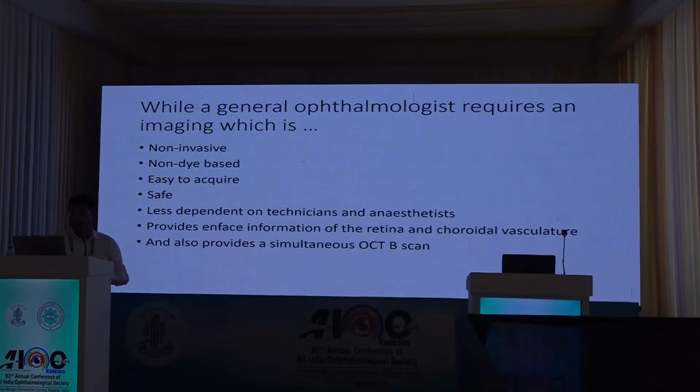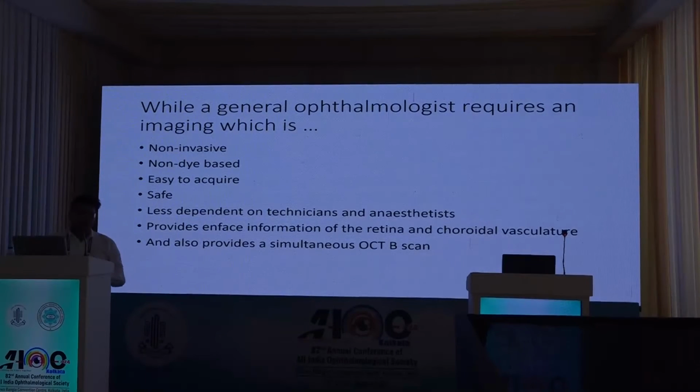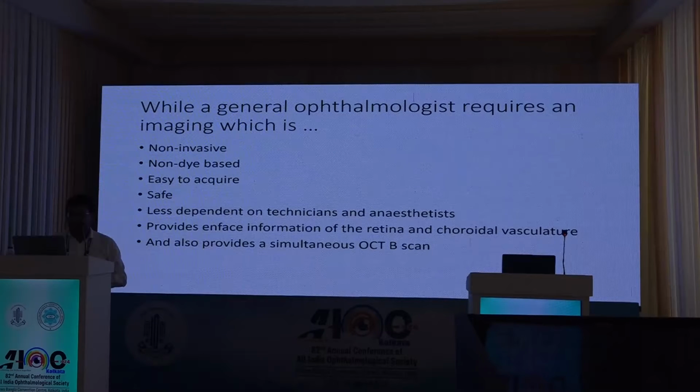While a general ophthalmologist requires imaging which is non-invasive in nature, non-dye-based, the images have to be easy to acquire, they should be safe without any exposure to allergic reactions, they are less dependent on the technicians and the anesthetists, and it also provides en face information of the retinal and the choroidal vasculature with segmentation, and also provides a simultaneous OCT scan.